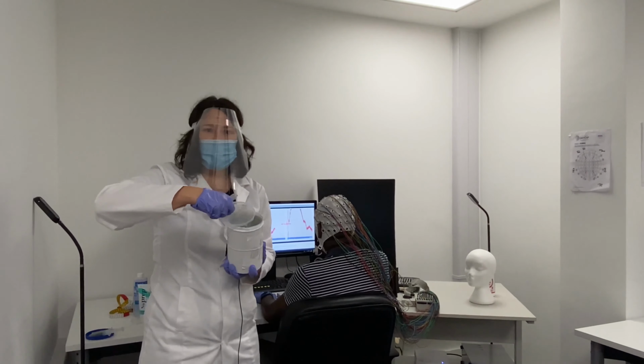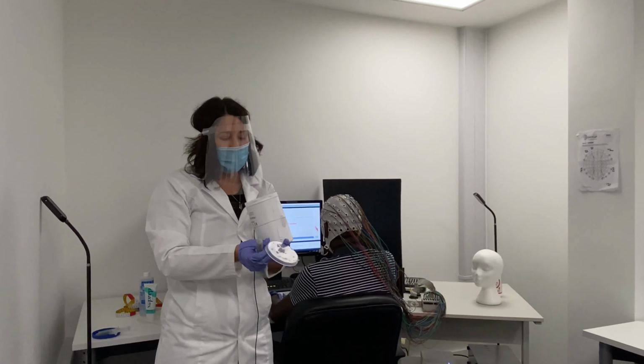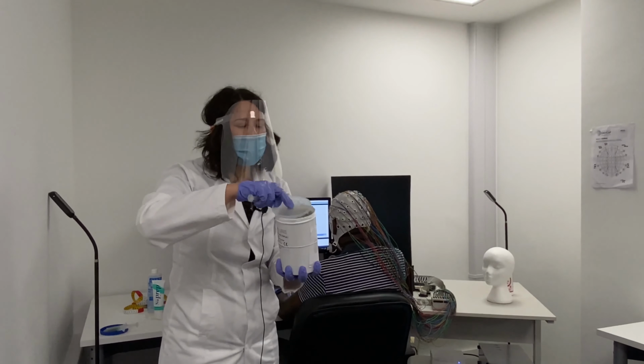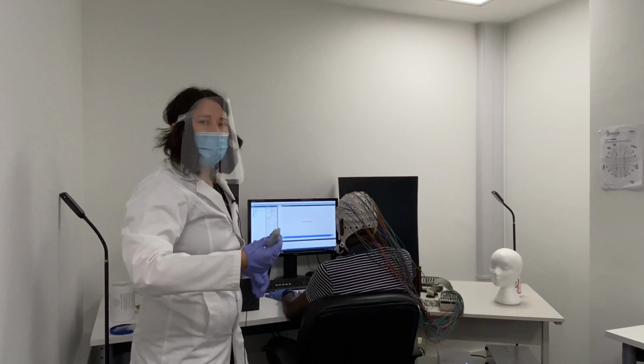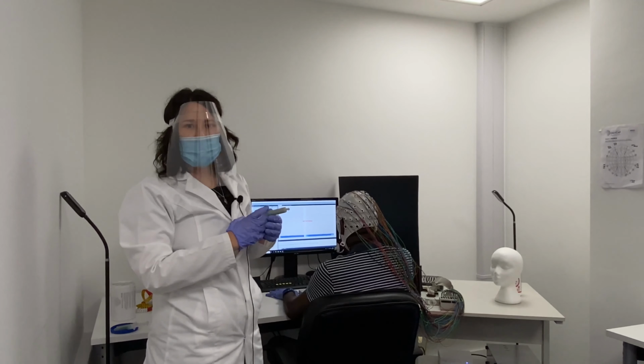The electrodes are just now sitting on the hair. We need to connect the electrode with the skin. For that reason, we are using EEG gel, which contains normally a little bit of salt or some abrasive element to prepare the skin underneath the hair.